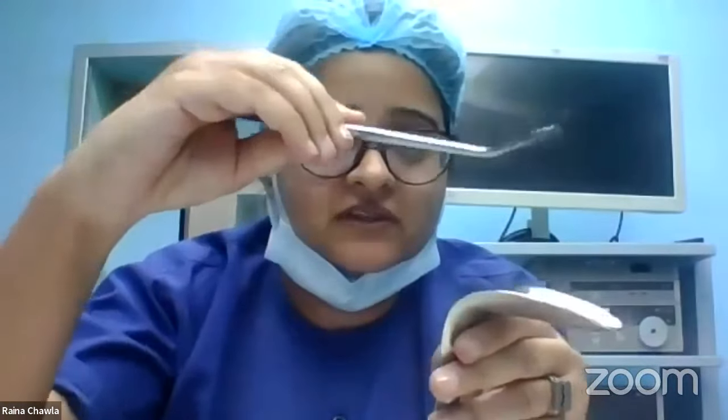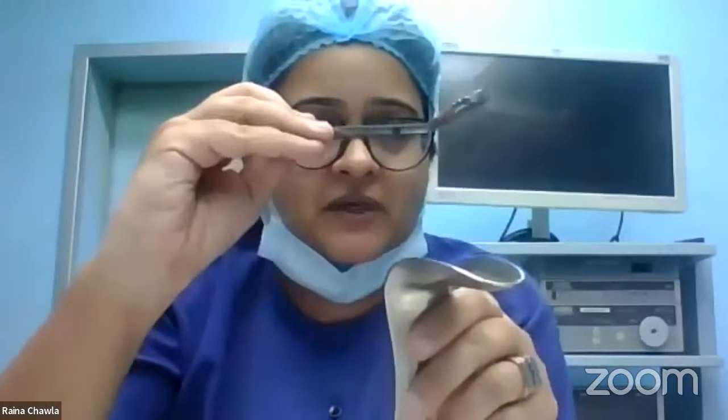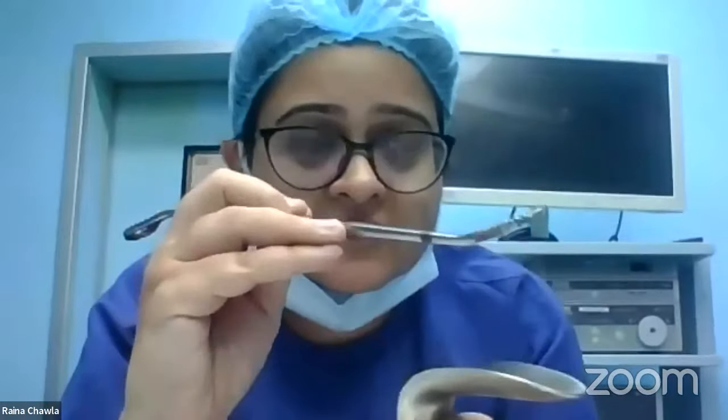So what we do is we introduce it in the vagina. We depress the posterior vaginal wall and then we lift the anterior vaginal wall with the anterior vaginal wall retractor. Because the vagina is closed, the anterior and posterior walls approximate. So we have to open it up to visualize the vaginal walls and the cervix inside. So this is how we introduce it, and then we lift it up using this instrument.